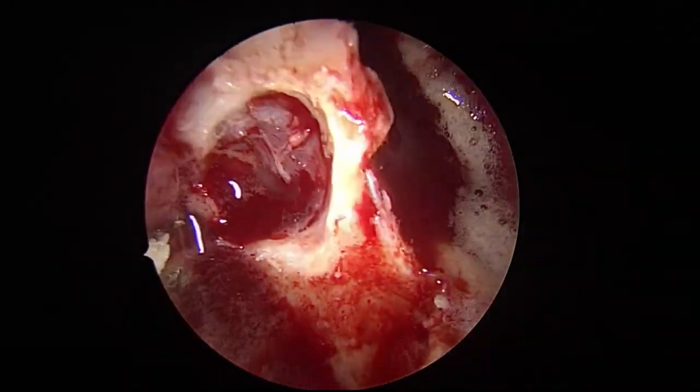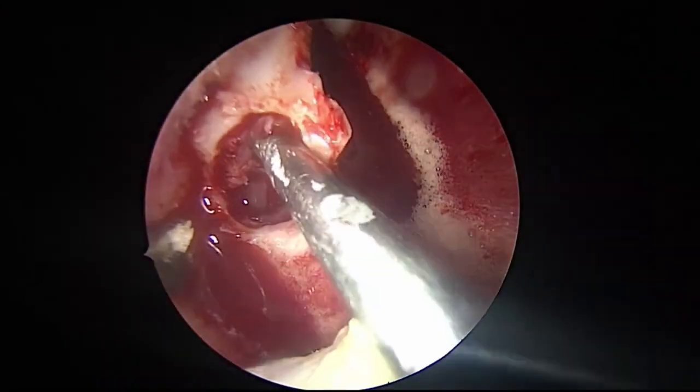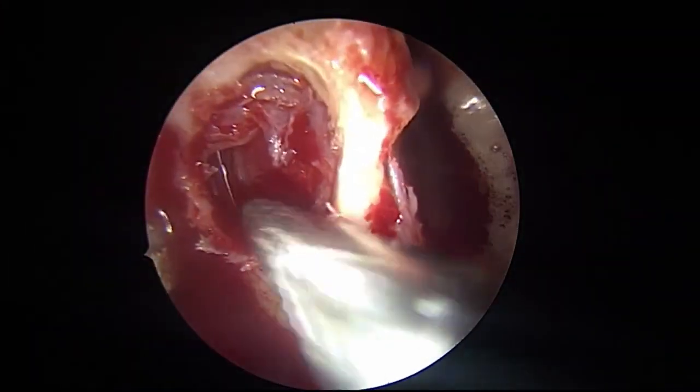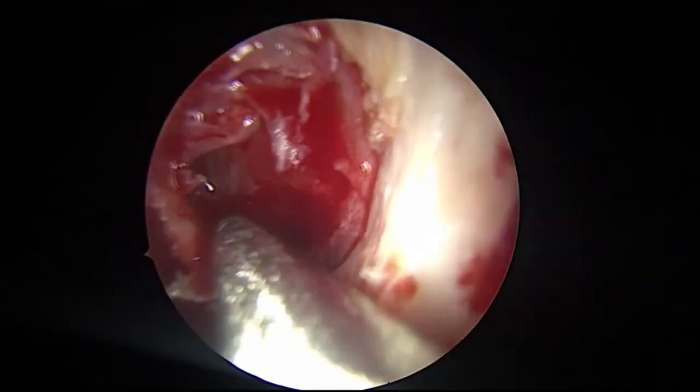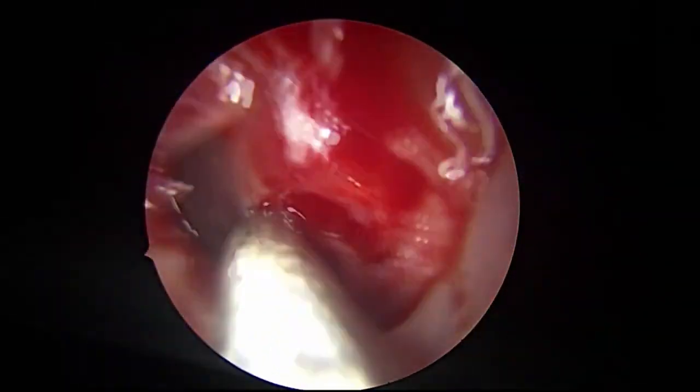That's the window. Suction. See, this is the lateral wall which is pushed laterally. Could you see? Yes, sir. In this case, we have seen the lateral wall is too laterally pushed by the tumor.